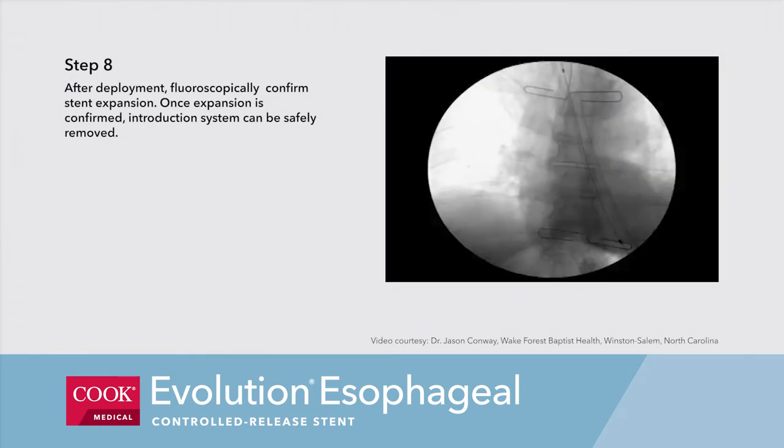Step 8. After deployment, fluoroscopically confirm stent expansion. Once expansion is confirmed, the introduction system can be safely removed.